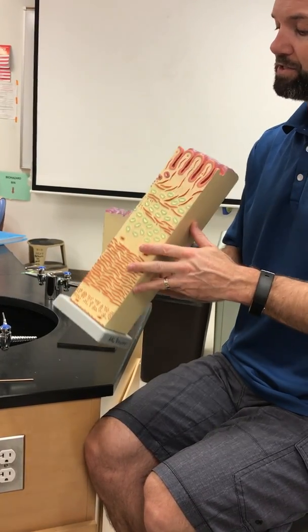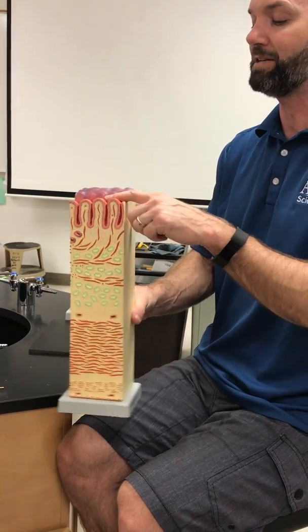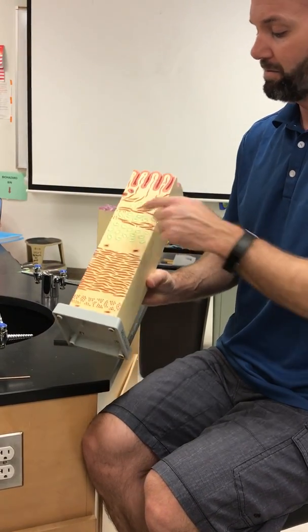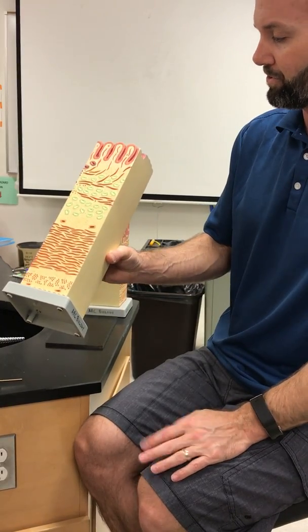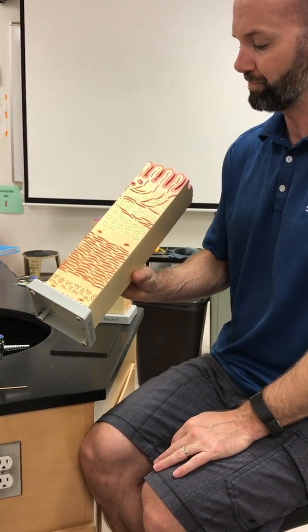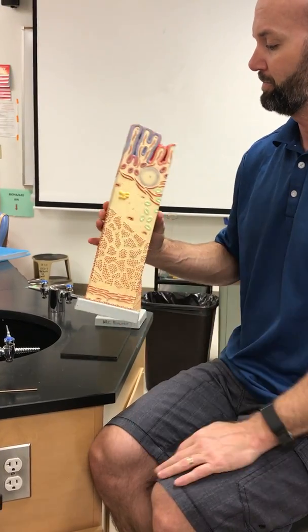And we know that this is duodenum, the beginning of the small intestine, and not ileum, the end, right? Because maybe ileum and colon, possibility, right? But this rules it out. You have all those submucosal glands, those are duodenal glands for sure. Follicle is pretty small, so not ileum, duodenum. So pyloric sphincter, we're right there.